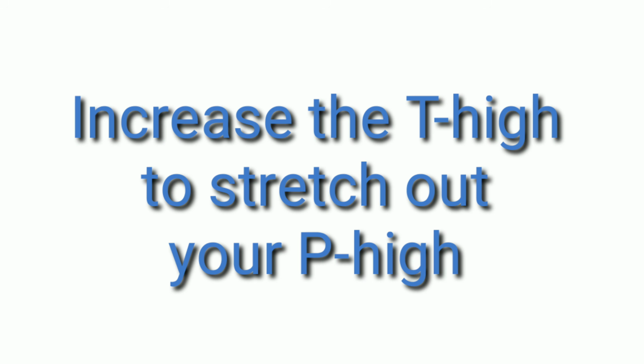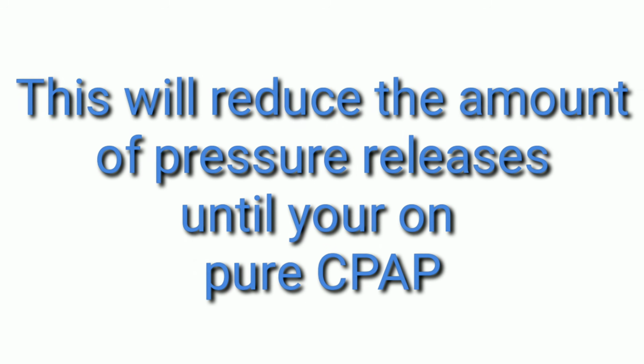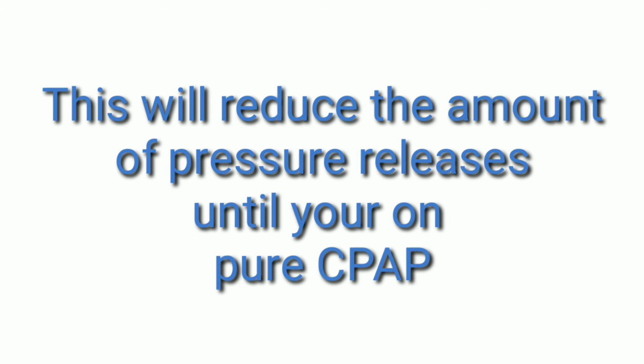And by stretching your T high, meaning the time on the higher level, you're getting the patient to complete CPAP.